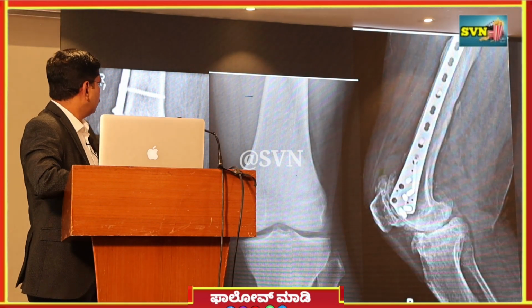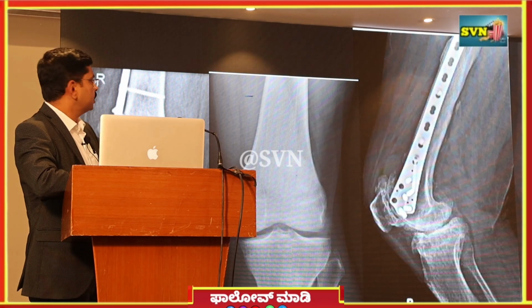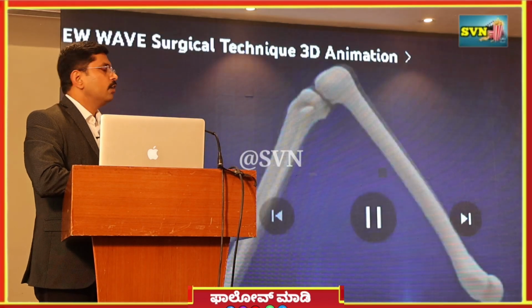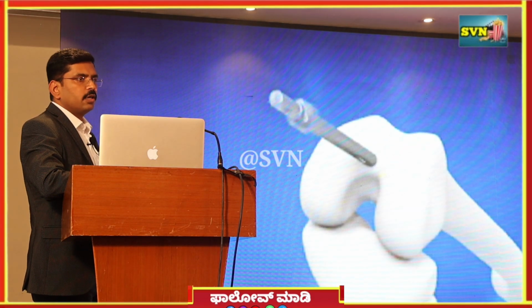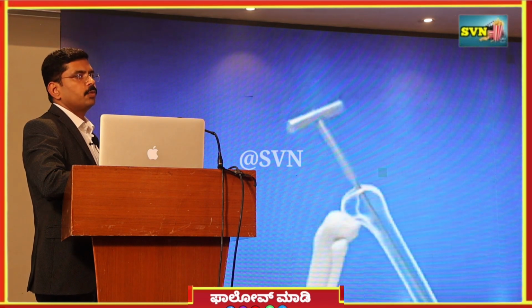Just for comparison, I have put a normal X-ray. This is the difference between his damaged knee and a normal knee. The same thing is on his lateral view also. So conventionally what we do, we expose the knee, we take a point on the knee joint, we pass a rod inside the knee joint so that we know the axis of the knee, so that we can keep the implant in proper position. For that, the rod has to go inside.